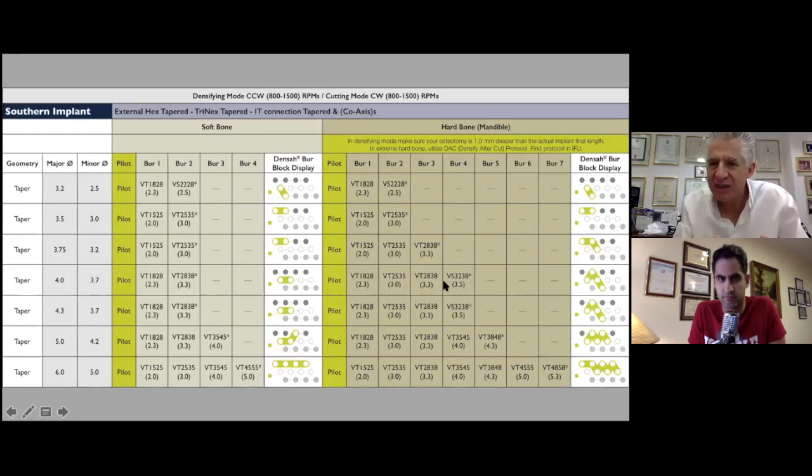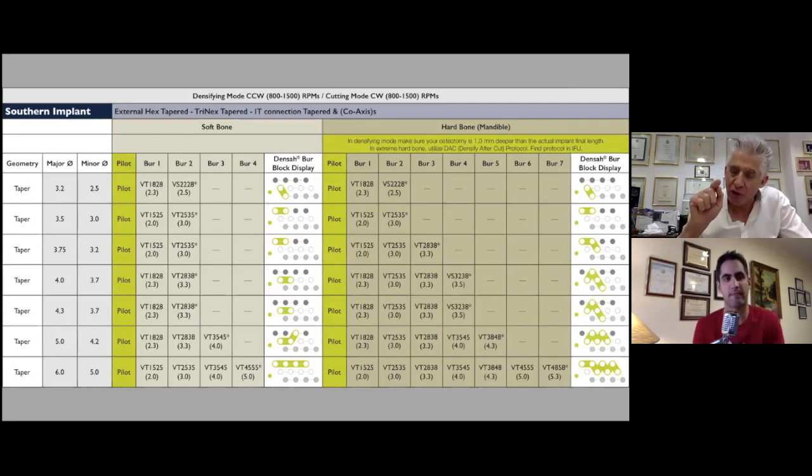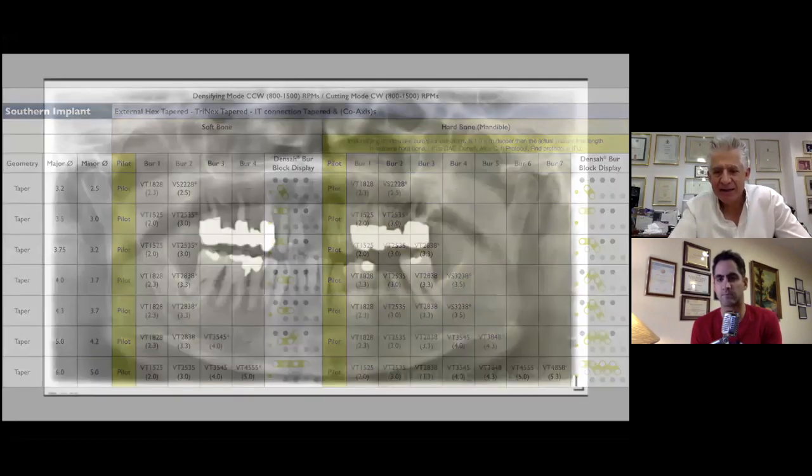And I asked them, how did you decide what drills to use? And the answer is, it was decided algorithmically. Which I'm not sure how many of us understand that. Maybe you do. Omid, you're a bright guy. I think it's got to do with mathematics. They've worked it out. Which are the most appropriate drills for your brand implant and the diameter that you want to use. So stick to this protocol. That's the bottom line. So this is our patient. And this is a 7-minute video.